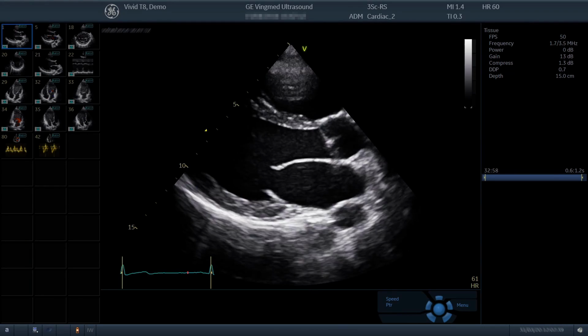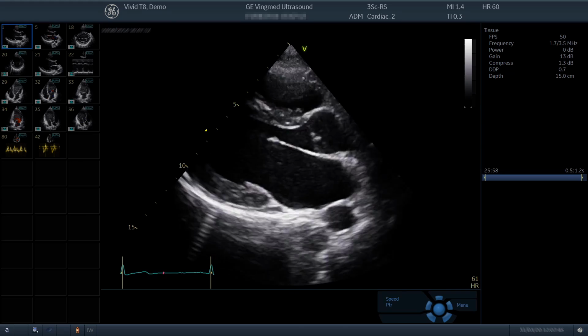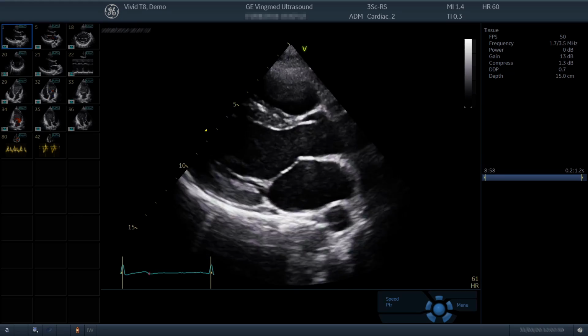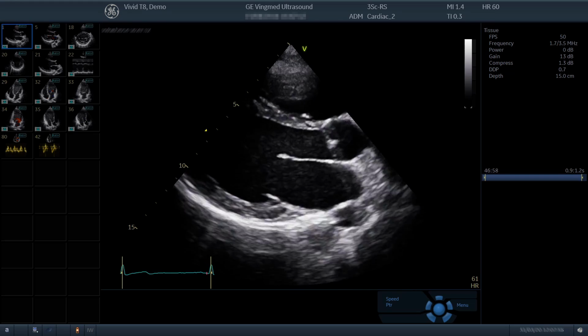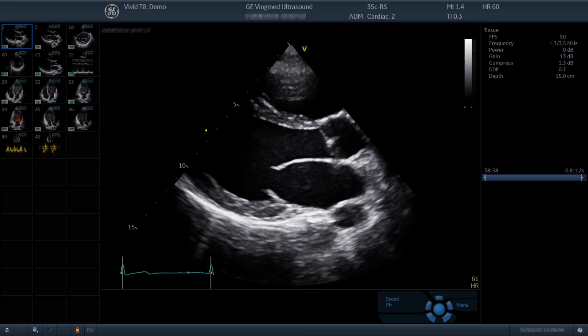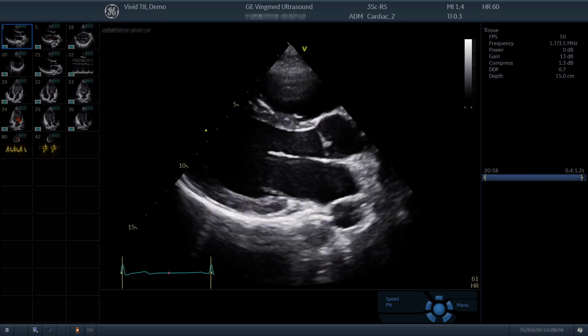According to guidelines and in order to minimize the exposure time to high viral load, the imaging should be limited to answer the relevant clinical question. For the same reason, ECG recording is not required and it is suggested to store loops and measure later in a safe place. Typically, we need to assess left and right ventricle function and major structural valve disease.